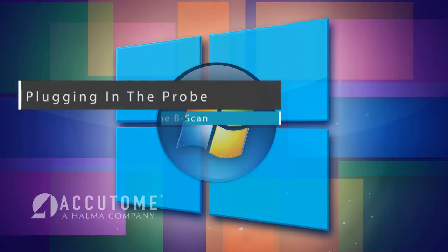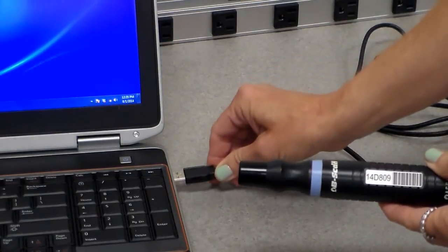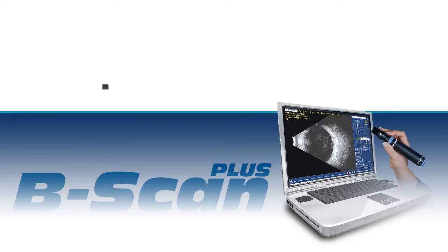Once the software is installed, you can plug the B-Scan probe into any operational USB adapter on the computer. The B-Scan probe will finish the installation of the software and be registered for the computer. Keep in mind it may take a few moments for the B-Scan probe to install once it is plugged into the computer.